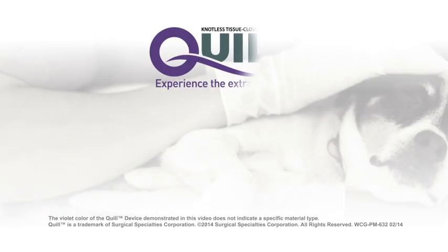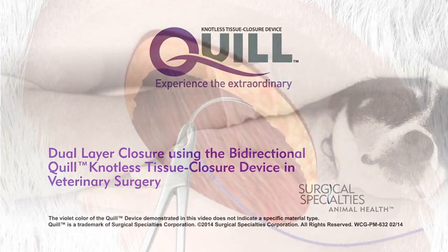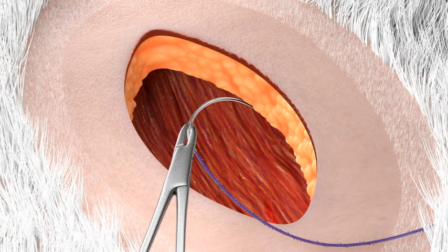The following video demonstrates a two-layer closure utilizing the Quill Bidirectional Knotless Tissue Closure Device. This is a layered incision. You begin by starting in the middle of the incision.